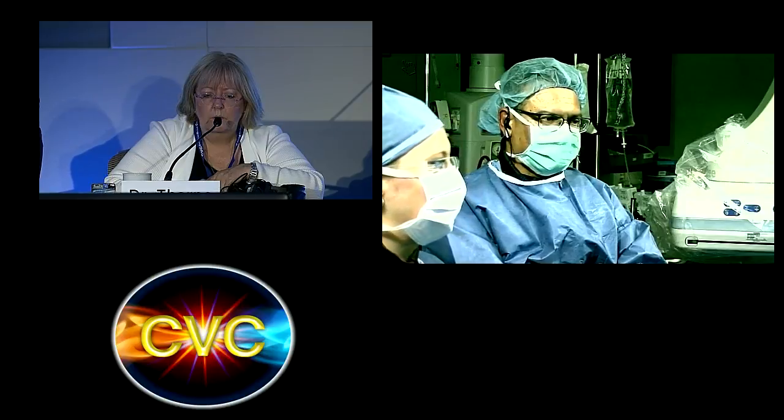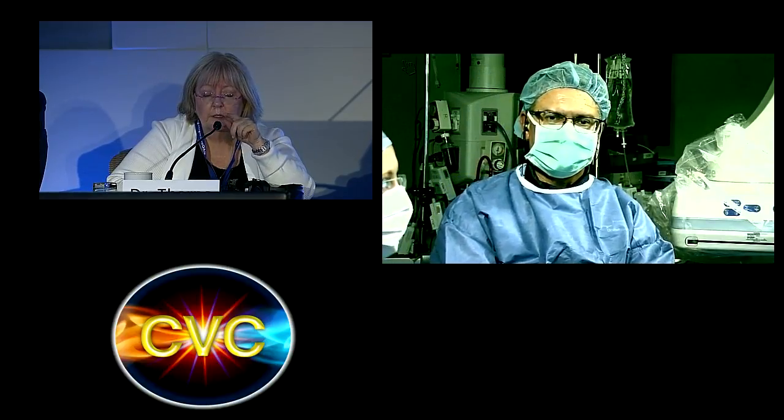Hopefully that will help with the changes on the skin, the edema, and the swelling that he had in the leg. But I think I'm pretty pleased with the results so far. Yeah, I think it looks pretty good, and you can get an ultrasound. Patty Zenda can do an ultrasound before you pull the sheath. If anything else shows up when he's on his back, you would then still be able to go in and do something.